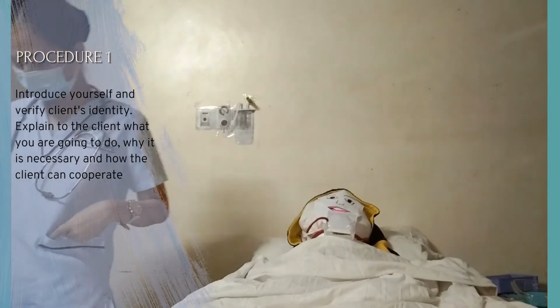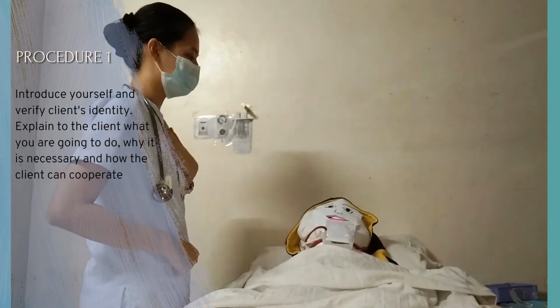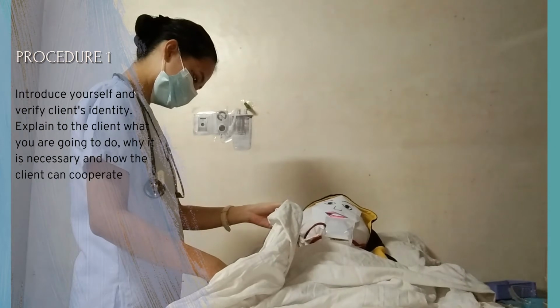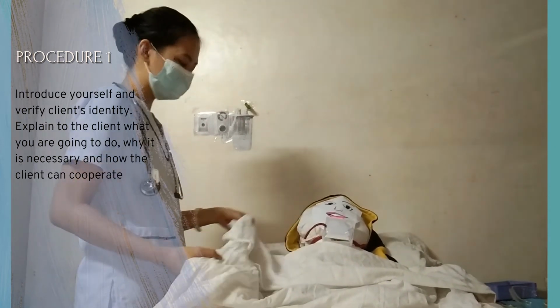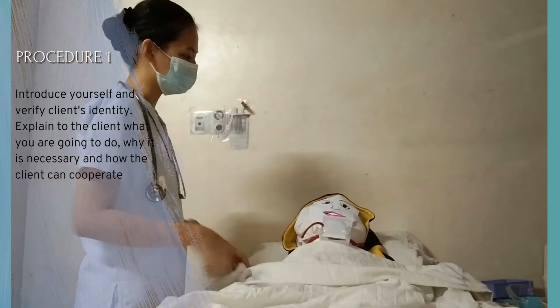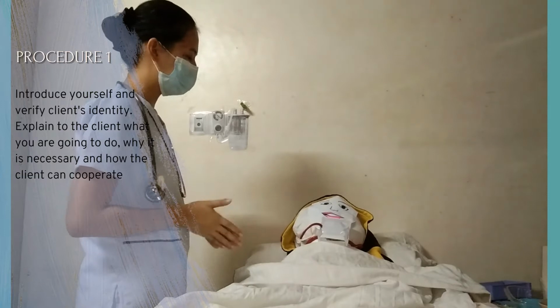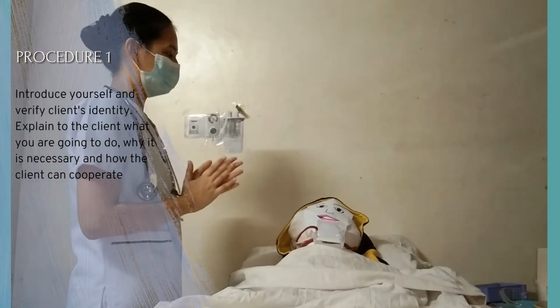Introduce yourself and verify the client's identity. Explain to the client what you are going to do and why it is necessary and how the client can cooperate. Provide for means of communication such as eye blinking or raising a finger to indicate pain or distress. Checking identification ensures client safety through the concept of correct procedure for correct client, and explanations can reduce anxiety and encourage cooperation with the procedure.